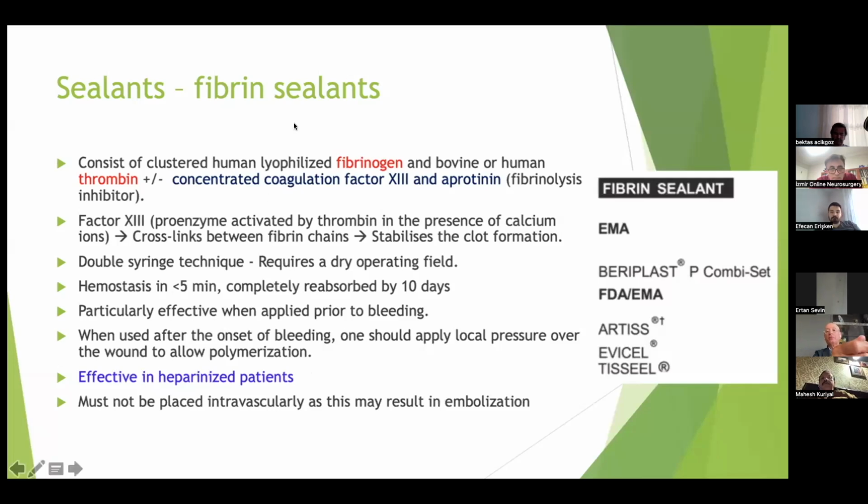We use fibrin sealants quite often, especially when there is a dural defect and all. But in hemostasis wise also, they are quite effective. More important point is it should not be used intravascularly, as it can result in embolization.